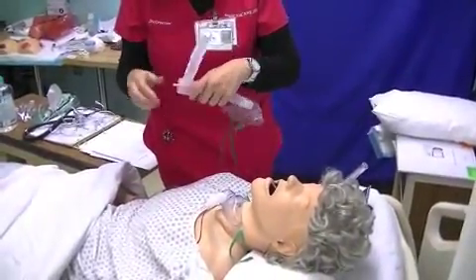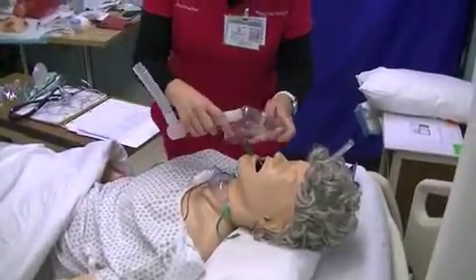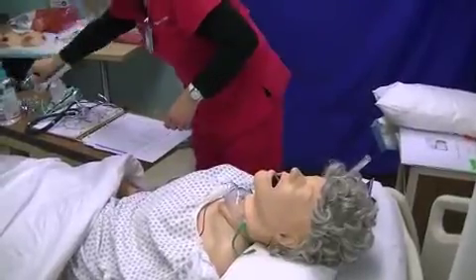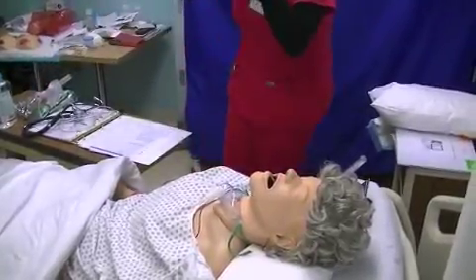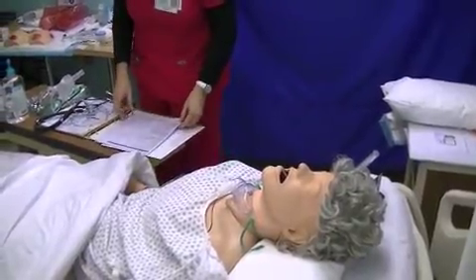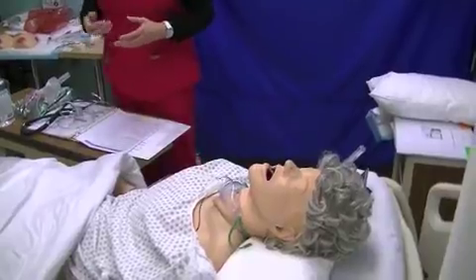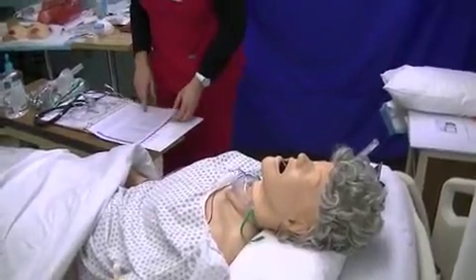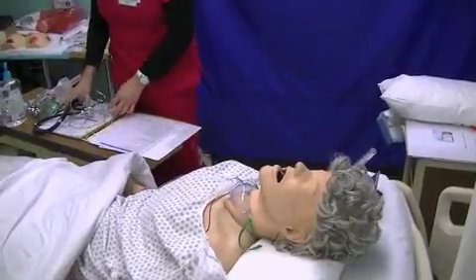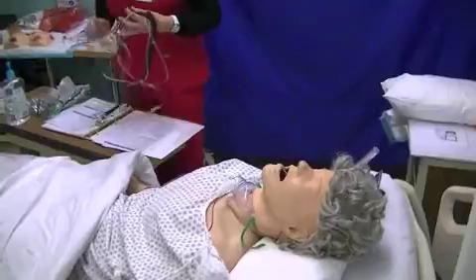This allows the condensation to drop out. This connects to oxygen tubing, and you put it on like any other mask. So that's for percentage of oxygen. Now, we want to make sure that the oxygen equipment is set up and working correctly before we leave the patient, and make sure it's delivering the prescribed rate. Now, before we leave the bedside, we're going to assess the respiratory status again.